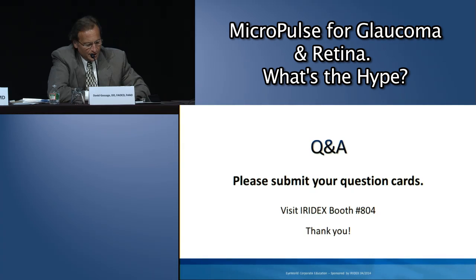And then the question is, if you have a laser and you're going to be using it for diabetic macular edema and also MLTs, what wavelength would you choose, yellow or green? From a comprehensive ophthalmologist's perspective, we've been so familiar with green wavelength lasers that we've been using them for years. I felt very comfortable using the green wavelength laser. I've had nice results with it. I did use the yellow for some time when we were trying out the new Texcel. I got a chance to use the 577, and I saw really nice results with it. I think if you're a retina person, you'd probably opt for the 577.